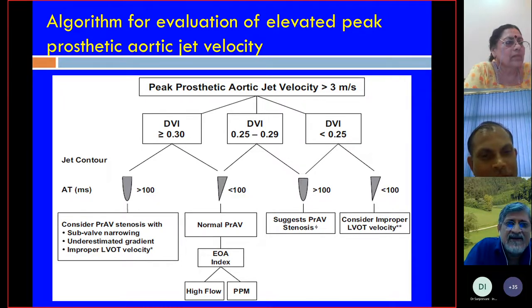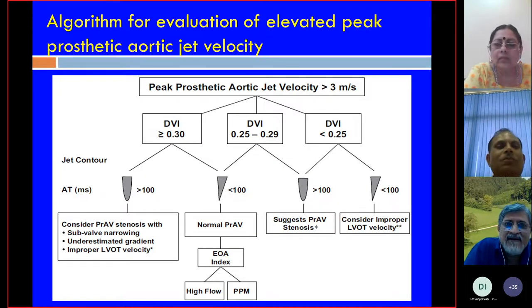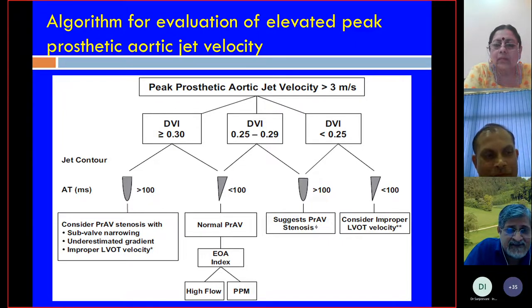If you want all major parameters, that is why these three parameters are more popular and more reliable in case of the aortic valve. In case of the mitral valve, because they are measured in different cardiac cycles, usually these parameters may be fraught with many inaccuracies.